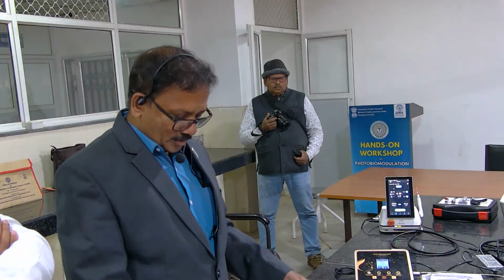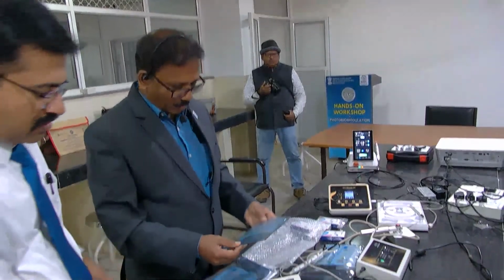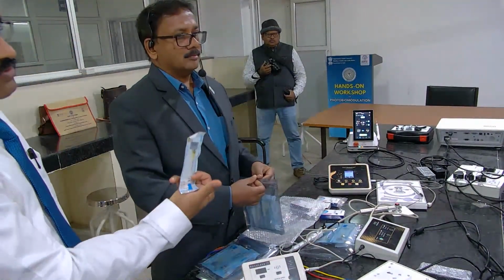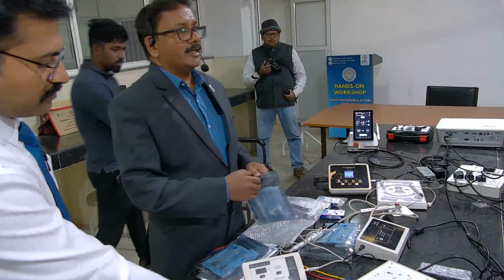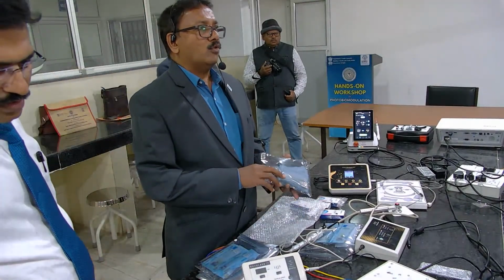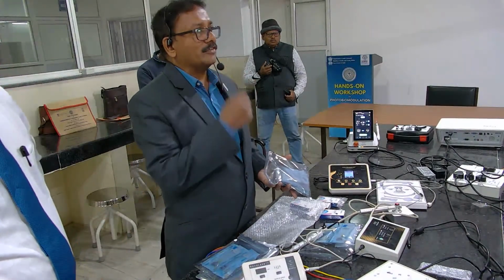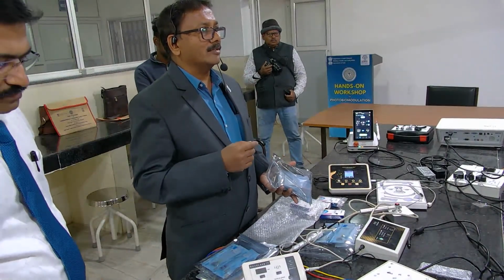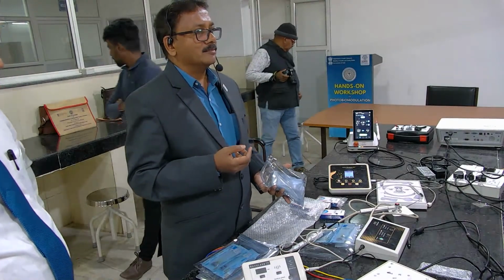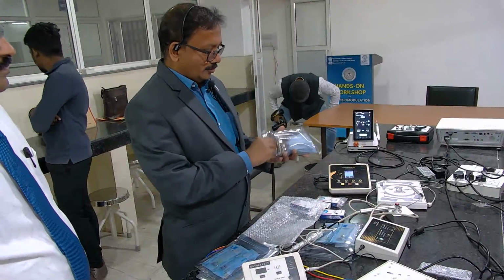So, in case you want to understand about these, we have three: 200 microns, 300 microns, and 400 microns. 400 microns you can use only in case of surgical cutting of the tissues, crown lengthening, operculectomy, gingivectomy, all these. Anything biopsy. I will just show you.